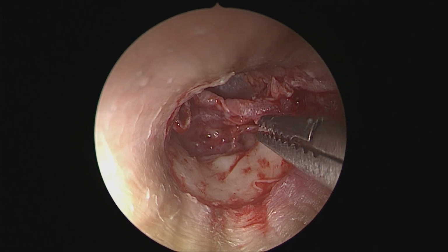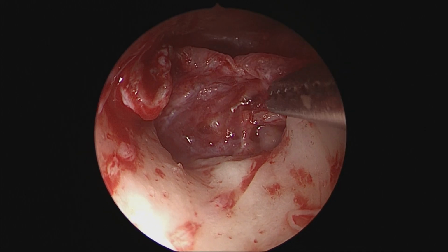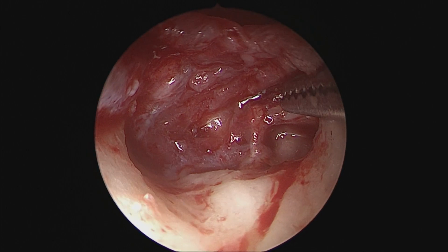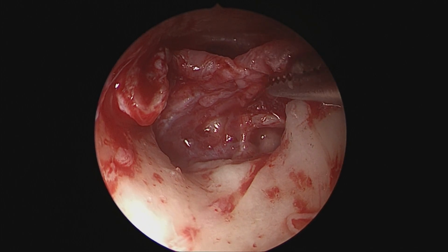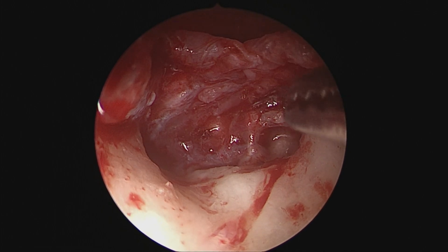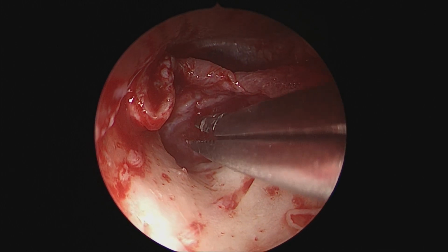So now we elevate and push this flap superiorly, slightly more anteriorly to the level of the malleus handle. Since the perforation does not involve the malleus, we would avoid baring it. And definitely what we desire in this patient is to examine the medial attic very carefully to again be sure that there is no squamous epithelium medial to this eroded ossicle, that is the incus.